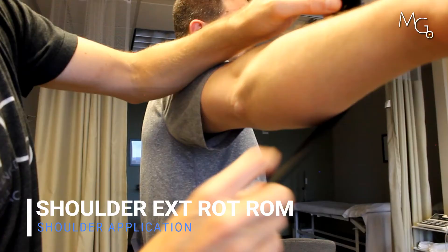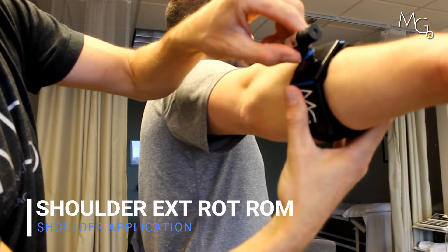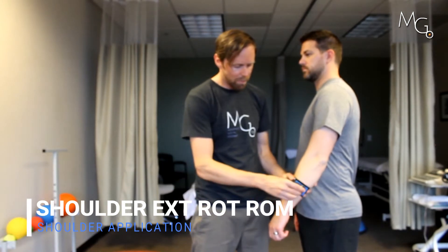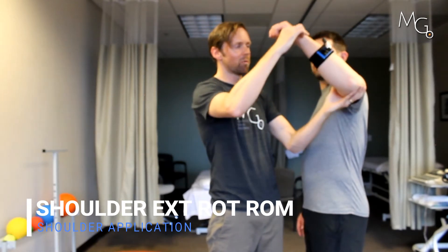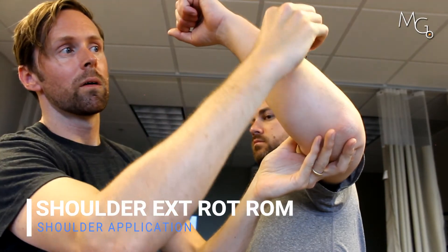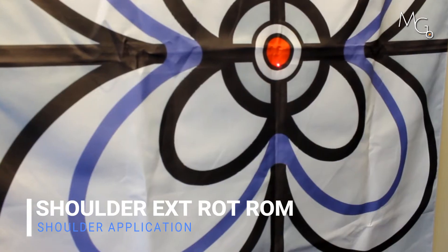I'm just going to put this around Chris's forearm here. Once we have the strap on Chris's forearm, I'm going to pop on the laser. I'm going to first bring him into a position that I want him to be in — let's say about 45 degrees external rotation. Then I can simply rotate that laser, turn it on, and aim it at a reference point. I'm going to aim it at this center line right here.